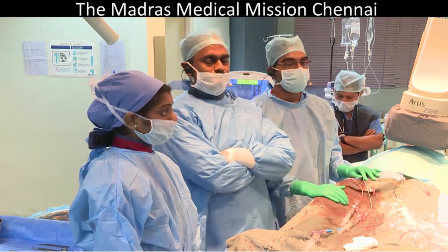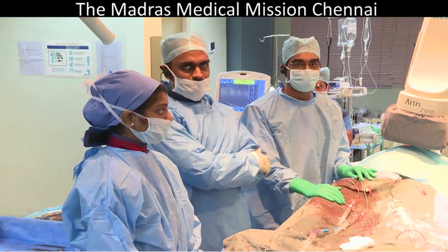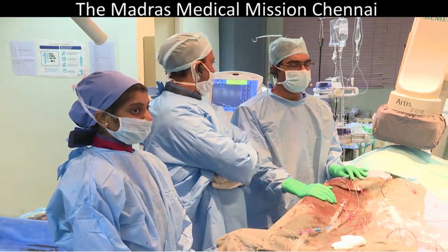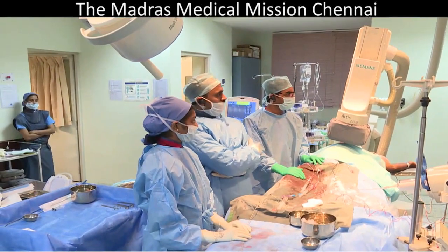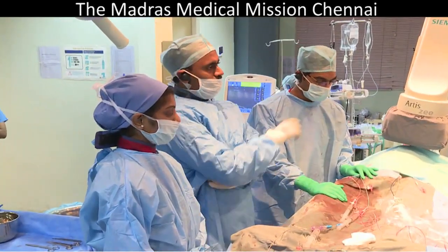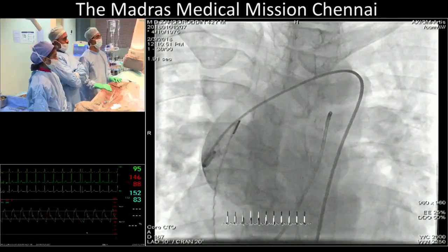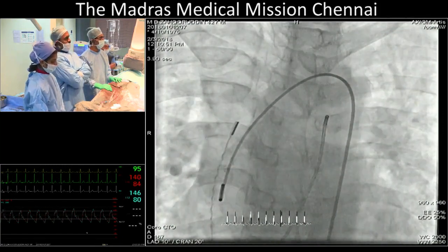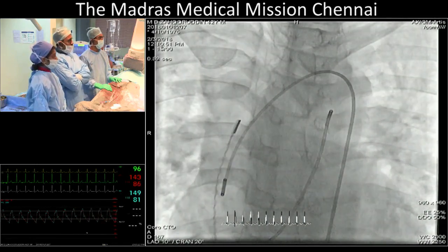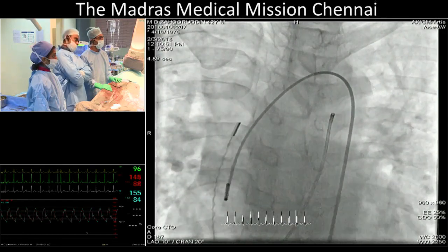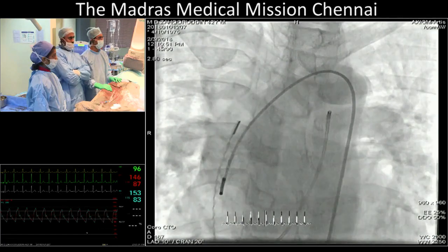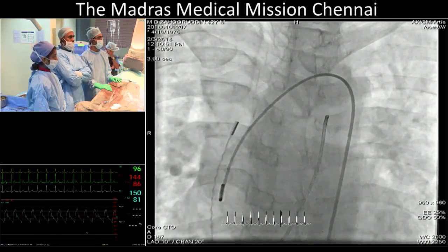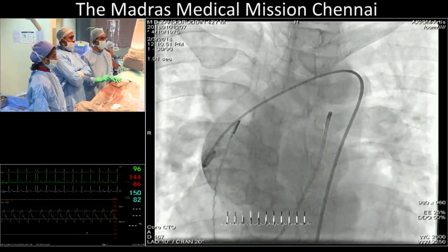With me is Dr. Uma Mageshwar, one of my senior colleagues, nurse Sharmila, technologist Mohammed, looking after the patient's comfort, and Janani showing the intracardiac echo pictures on fluoroscopy live. We took arterial and venous punctures. We have the intracardiac echo catheter in the superior vena cava focusing towards the AP window. We had an aortic pulse pressure of around 75 mmHg. The pulmonary artery systolic pressure was around 40 to 45 systolic with a mean of 30 to 31, and there was a sizeable left-to-right shunt.